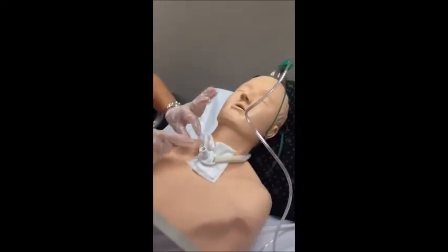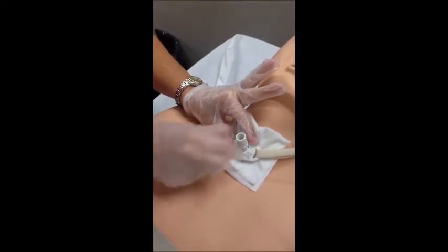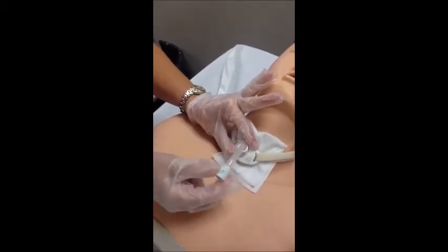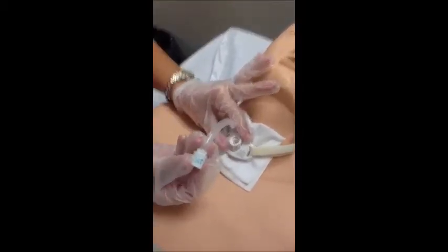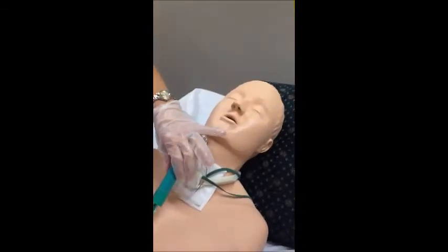I'm going to take this inner cannula out, and we want you to stabilize the faceplate. As you turn it, it locks and you pull it out. See the wording on there says lock that direction. So I'm taking this out, and I'm going to put it over here in my mixture. I'm going to put their oxygen back on them.